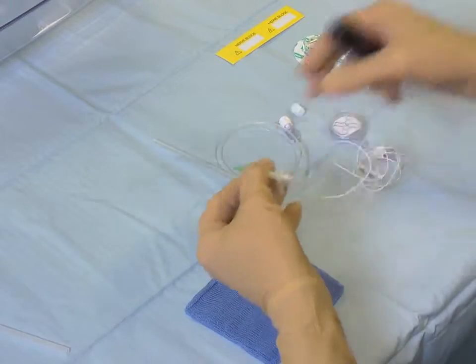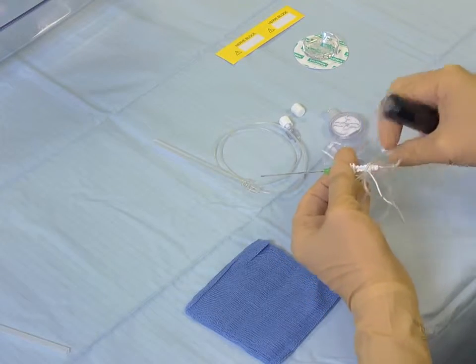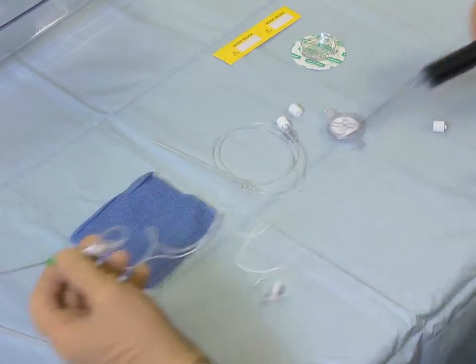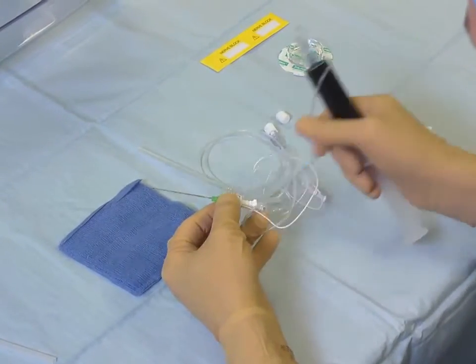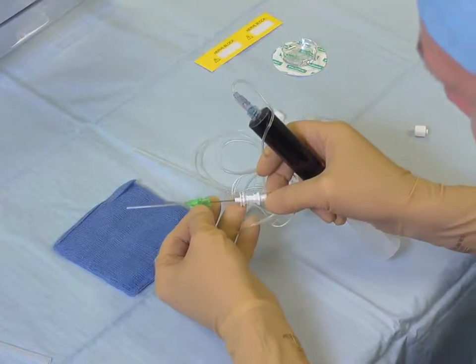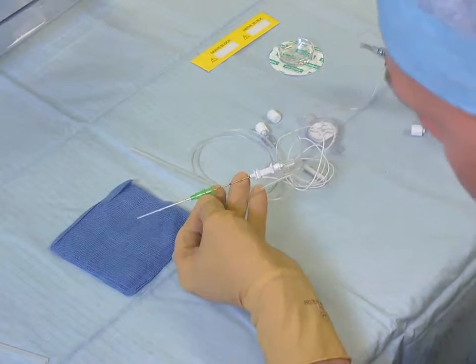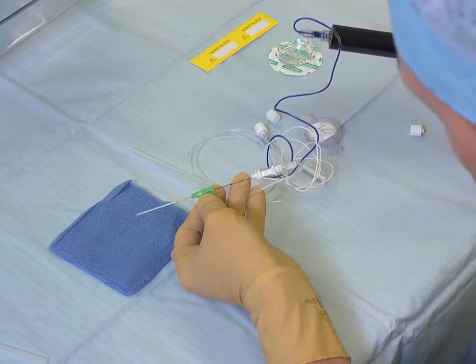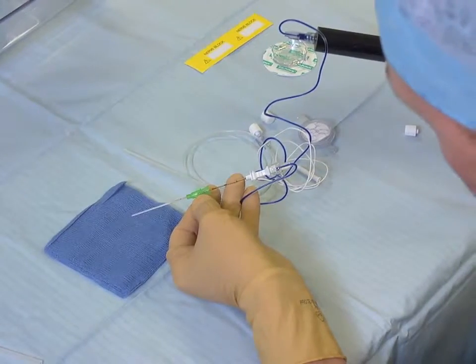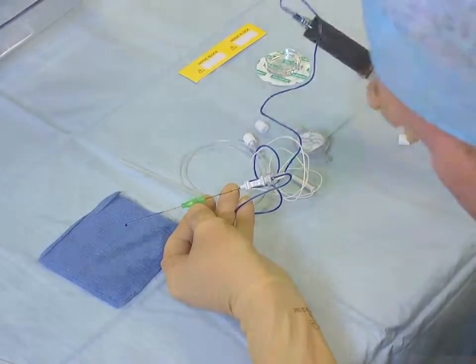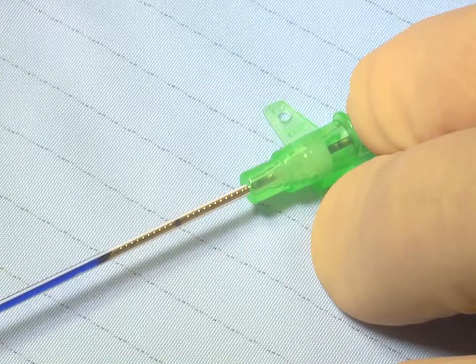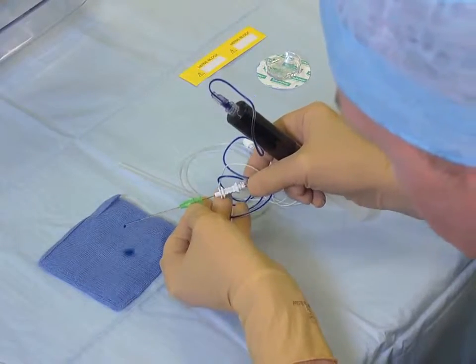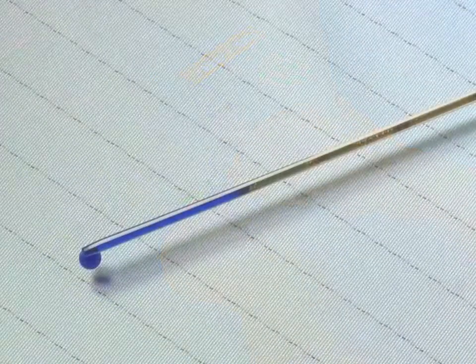Before inserting the E-Cath, it is important to set up the system appropriately. This will ensure that you get maximum visibility from the needle when it's inserted into the patient. Withdraw the needle from the outer sheath, the component with the green hub, until about 1cm is left inside the sheath. Slowly inject fluid so the needle and the sheath are primed. You will see that the 1cm exit point on the needle will help to prime the cornerstones. Advance the needle completely back into the sheath, so it's back into its original configuration.